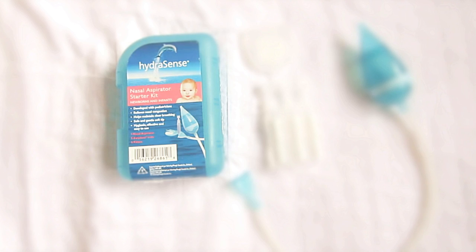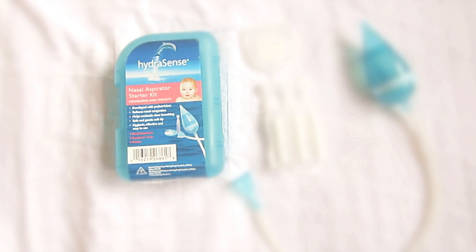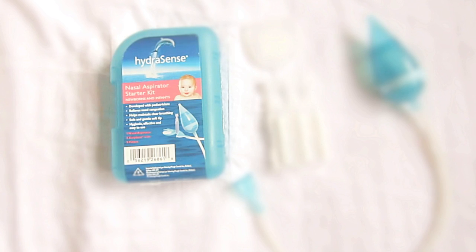HydraSense nasal aspirator starter kit for newborns and infants. It's developed with pediatricians, relieves nasal congestion, helps maintain clear breathing, safe and gentle soft tip, hygienic, effective and easy to use.